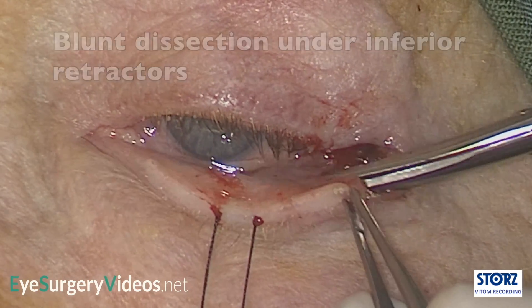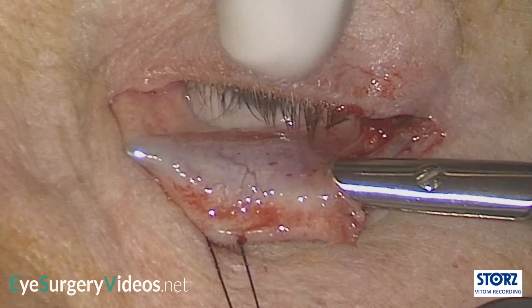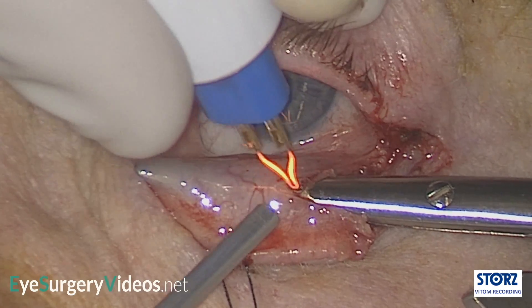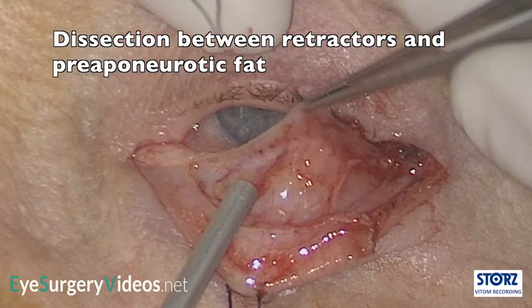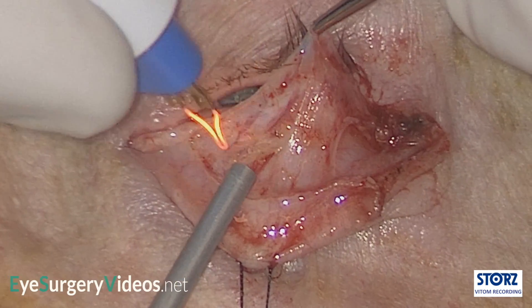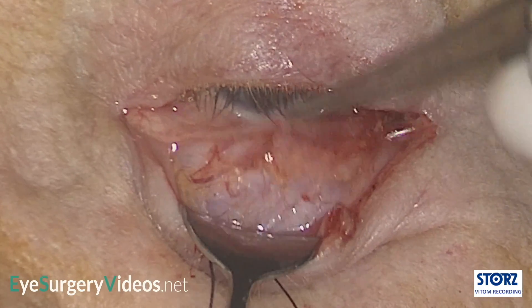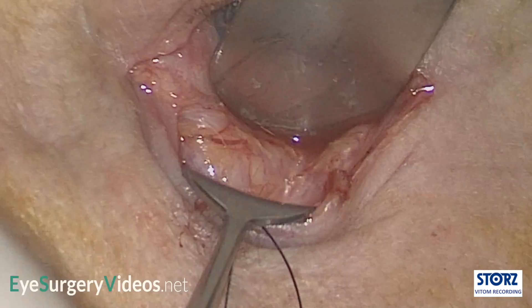The conjunctiva and inferior retractors are then cut using a hot wire, just inferior to the tarsal plate. The space between the retractors and the aponeurotic fat pad is then dissected. The inferior orbital rim is then brought into view by retracting the lower eyelid anteriorly and inferiorly with DeMar retractors, and the malleable retractor is then used to retract and protect the globe. The tissues are then stretched over the orbital rim and the periosteum is incised.